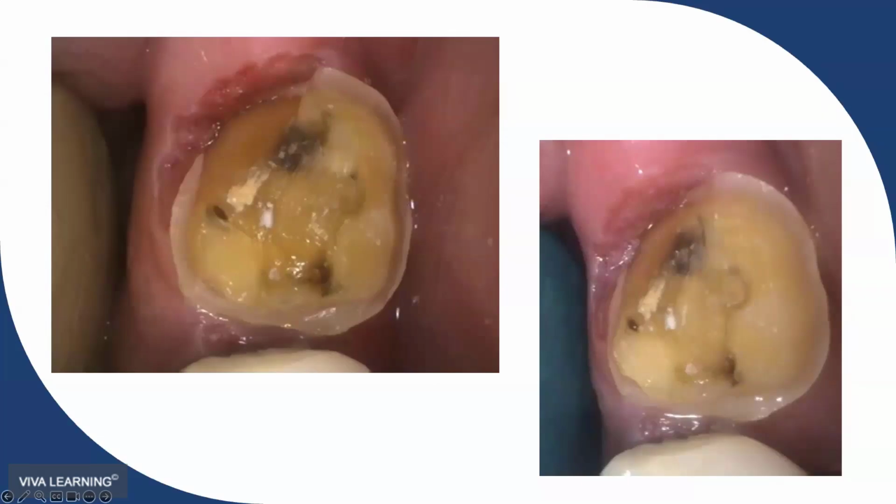But Aaron, to your question, very often, because this is an end cutting device, I will often use a side cutting device like a handpiece to break a contact, refine the prep, just kind of cheat with that side cutting device, no problem at all. When you're cutting a tooth, it's also creating an analgesic effect as it cuts that tooth.